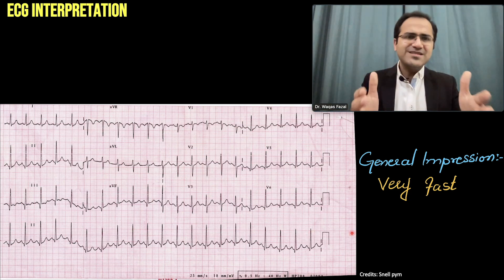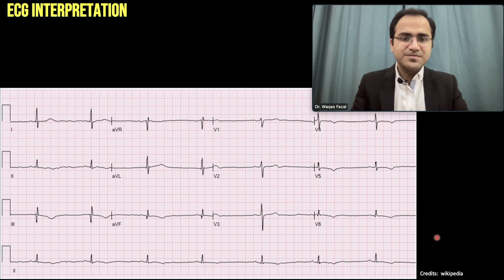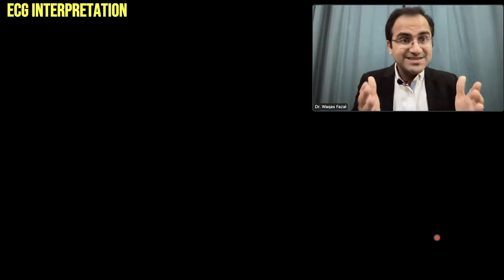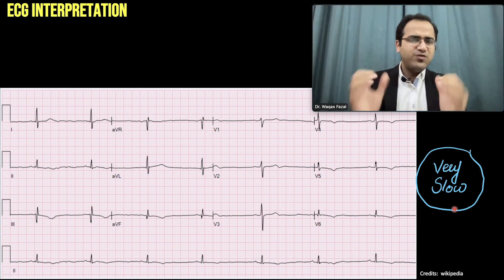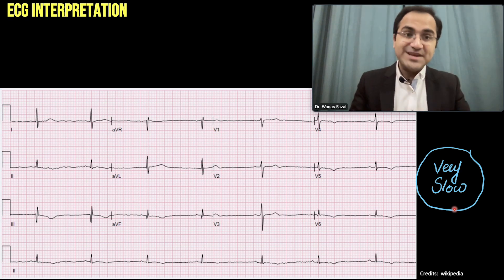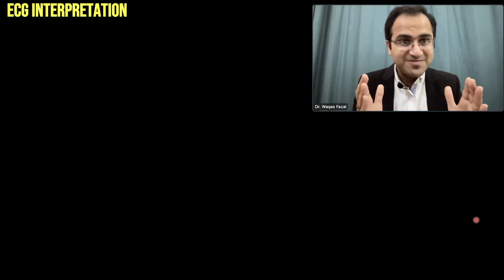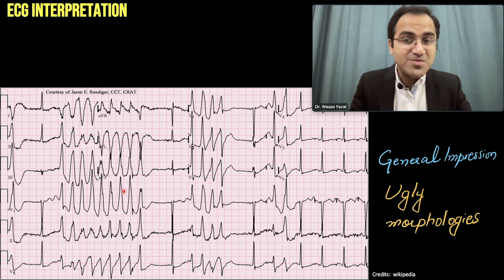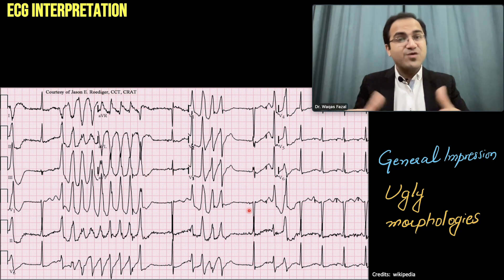Now going to the second ECG — look at it for 2-3 seconds and see what is your general impression. The general impression of this ECG is that it is a very slow rhythm. The first-glance impression is that it is a slow ECG. Moving to the next one: the first-glance impression should be that there are ugly morphologies present in the ECG — these are abnormal rhythms. So from the very first glance, we get an impression of ugly morphologies.